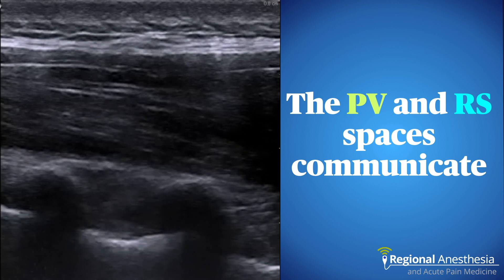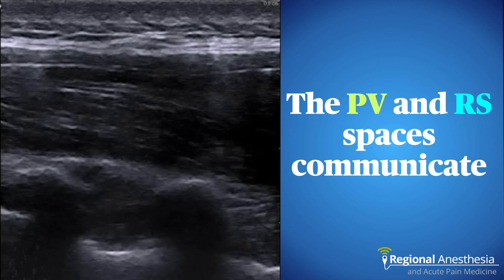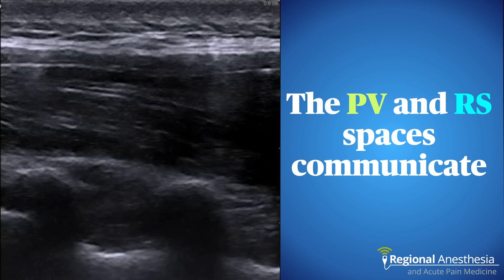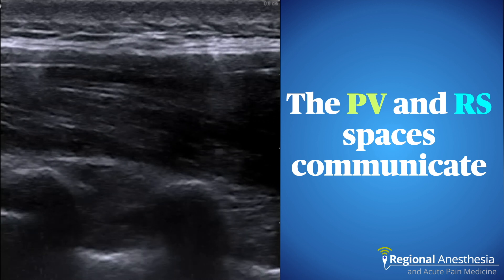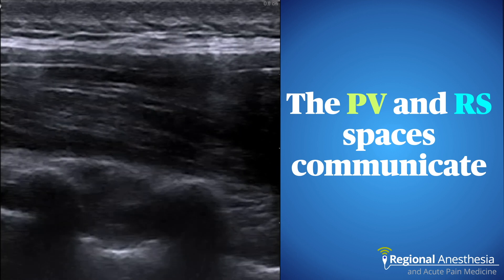In this clip we can clearly see the pleura being pushed down, indicating placement in the paravertebral space. Near the end of the 5 mL injection, we can also see the ventral erector spinae muscle bowing upwards, nicely demonstrating flow between the two compartments. Here it is sped up for clarity.